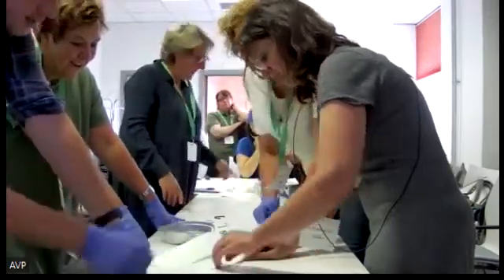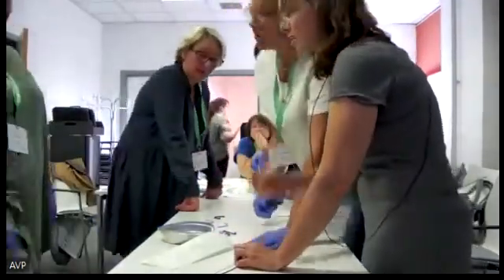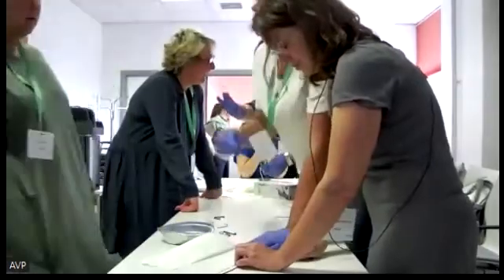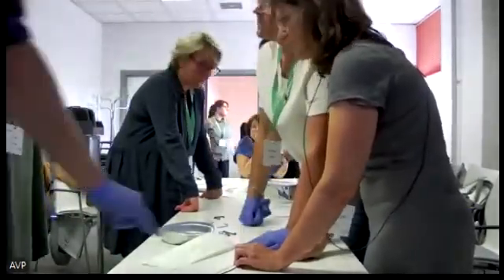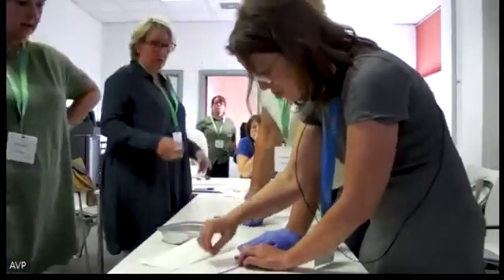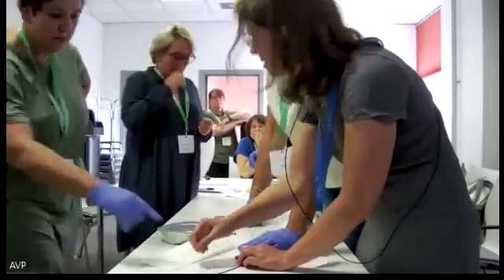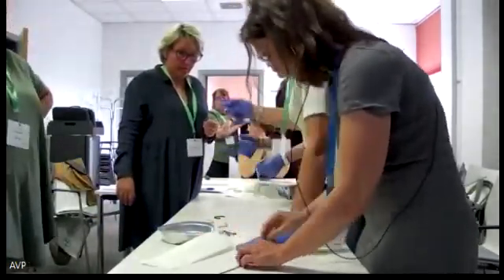Look, so we push, now it's back, parallel. We push back, and we can release the first stent. And this one is still inside, ready for the other stent. This is the only part where these two are together. It's the 10 centimeters. We didn't know that.